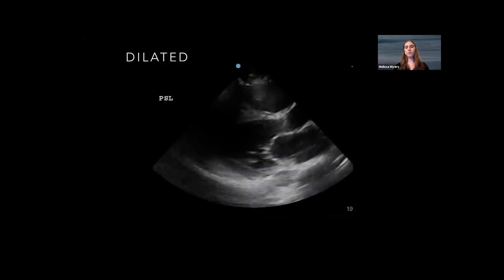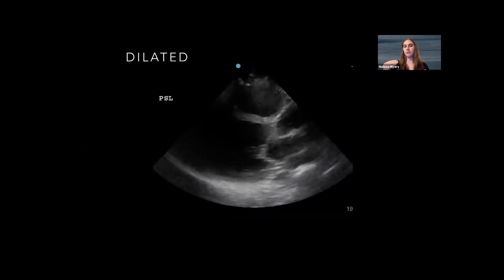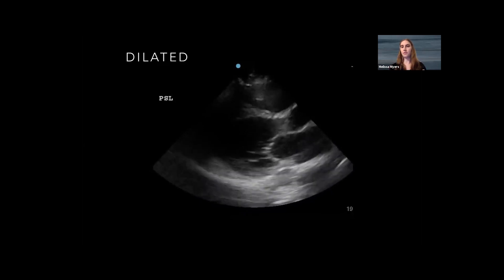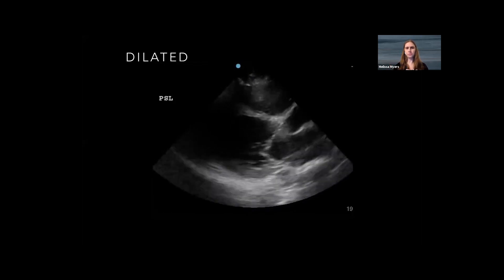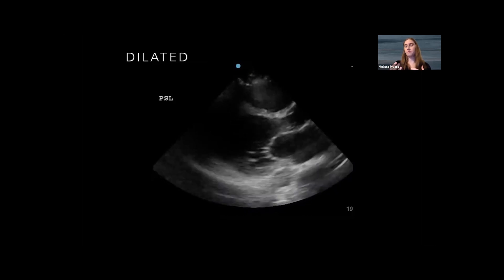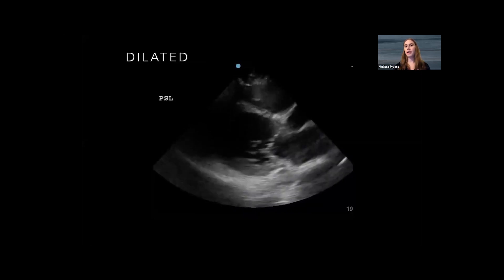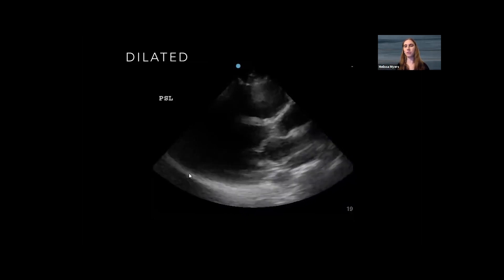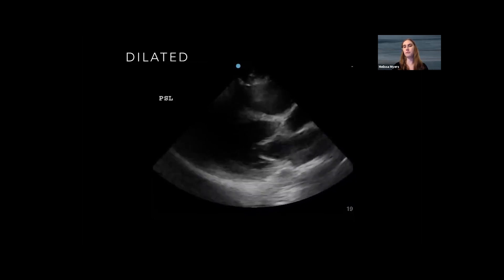Looking at this image, the right ventricular outflow tract — the chamber at the top of the screen — is significantly larger than the aortic outflow tract or the left atrium. Although we might normally use this view to look at the left ventricle, we can look at the right ventricle too. Often when we talk about looking at the right ventricle, we only talk about the apical four chamber view, and in a critically ill patient we might not be able to get that view. So it's important to realize you can start looking for right heart dysfunction right here in the parasternal long axis.